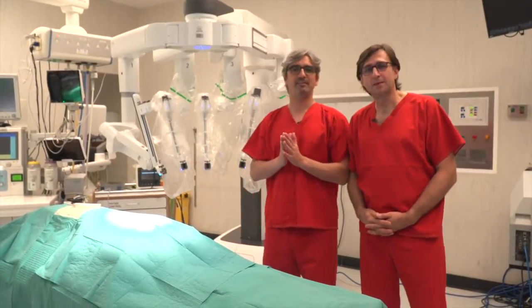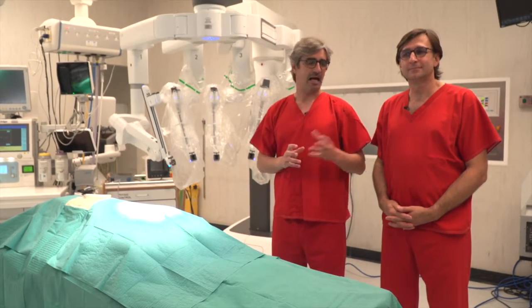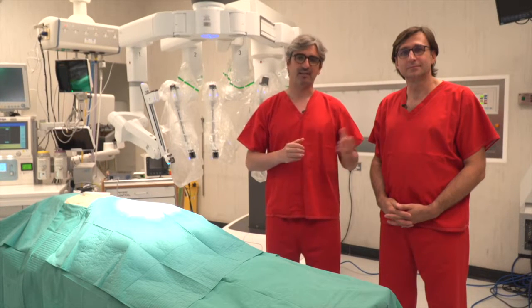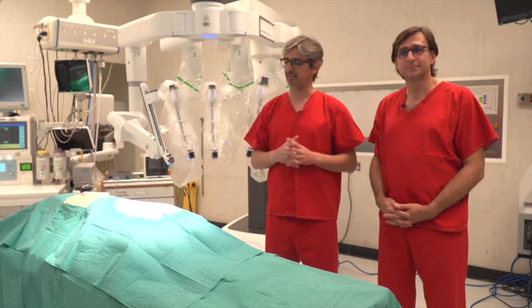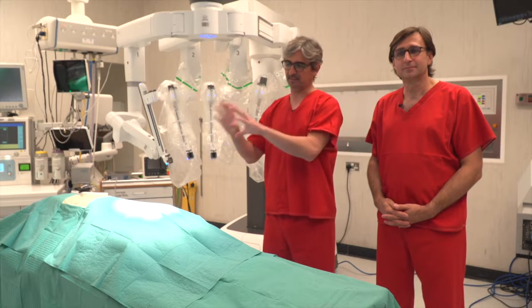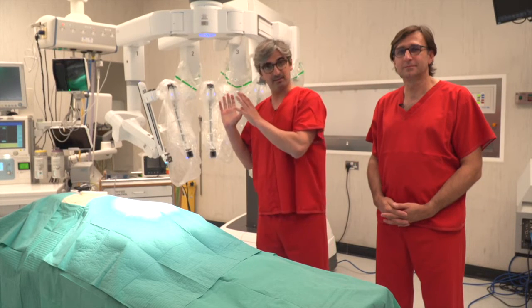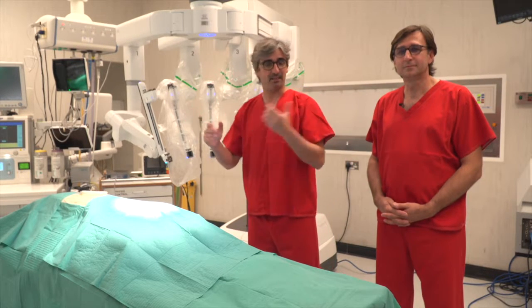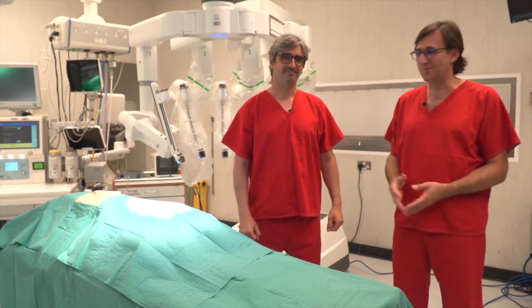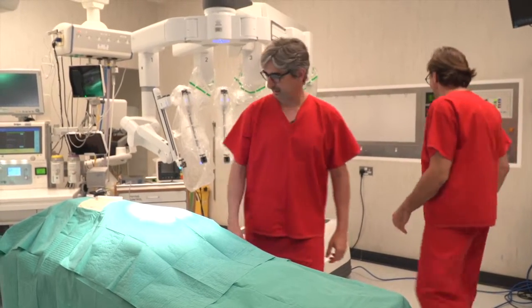We are going to show how we set up the arms, how we place the robot through a single decision. I am with Mugur Bosinciano, he is my partner in Uniportal RATS. We work together as a team — this is teamwork, 50/50. He is so important in doing this setup. We are going to show how we move the robot, how we place the arms and how we do the configuration. So, let's drive.